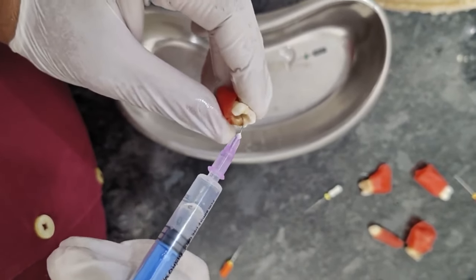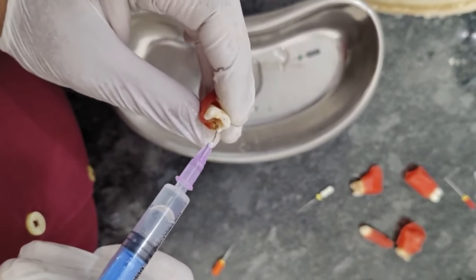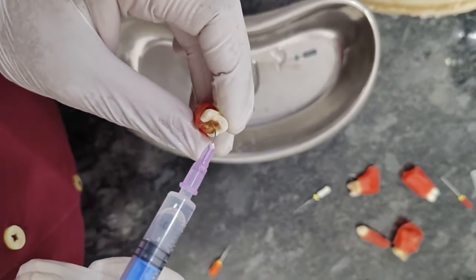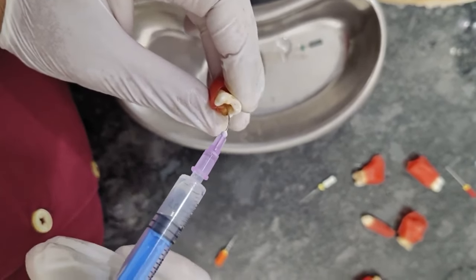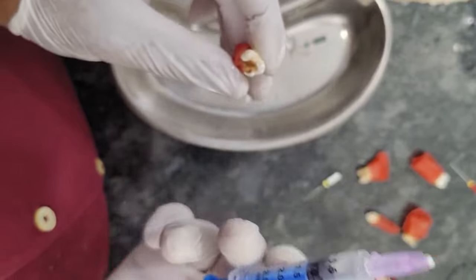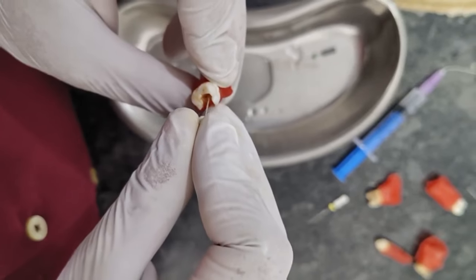So now we irrigate all the three canals. How much irrigation should we do? We should approximately use 20 to 25 ml of sodium hypochlorite in each canal. That means around 10 to 11 syringes of 2.5 ml. Ready?